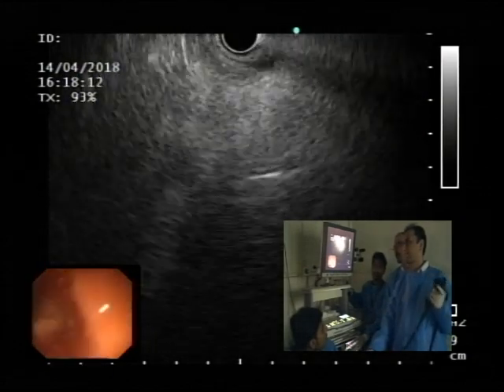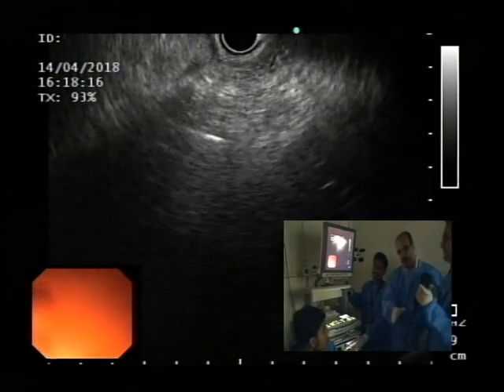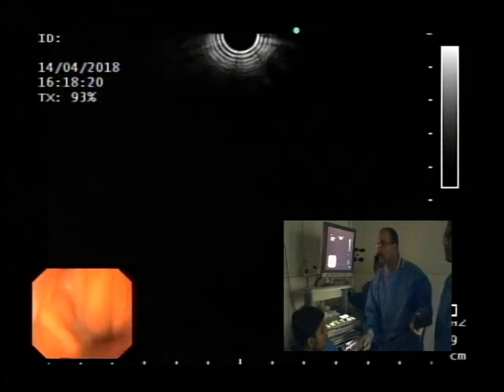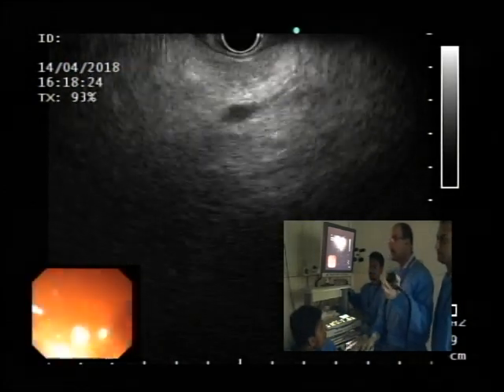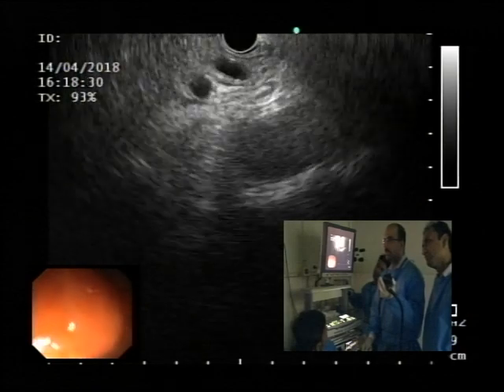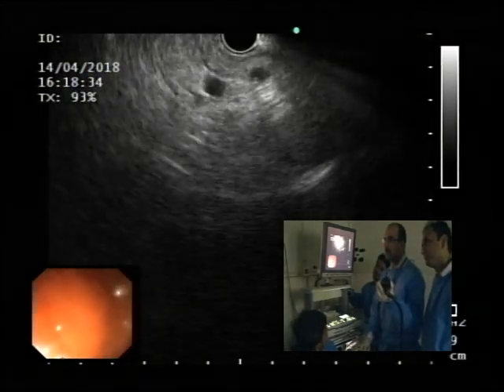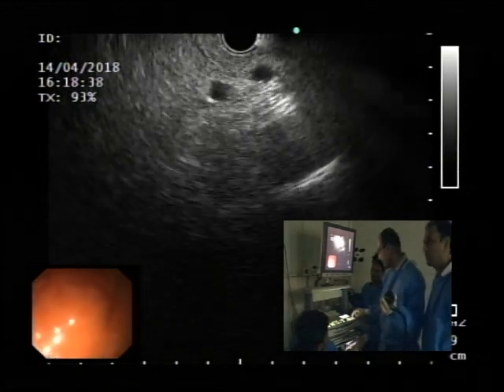That to me looked like maybe spleen, but I really can't tell. Let me take over for a minute because this is not obviously that straightforward. Take care. Nahi sahi hai. So now we're starting to see a vessel, right? This looks like a vessel. Right. So I'm going to follow it back. And as I follow these vessels back, now I'm starting to recognize structures from my memory, not necessarily anything obvious.